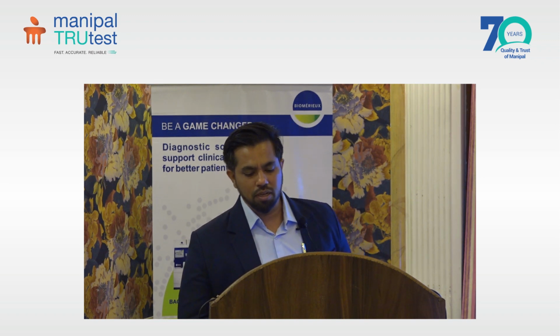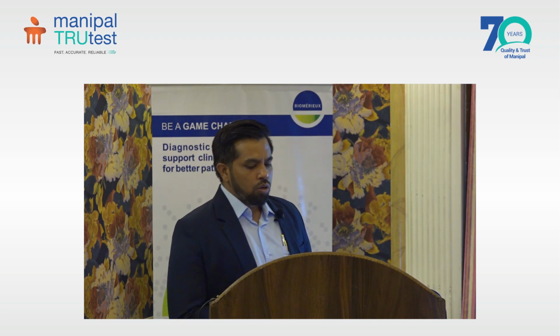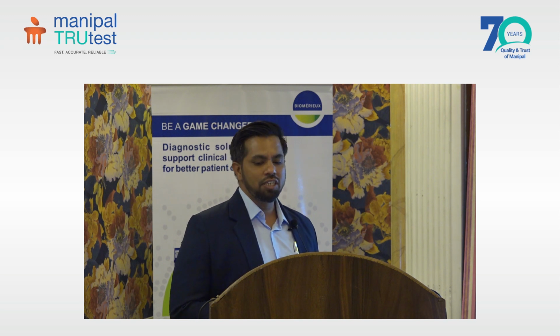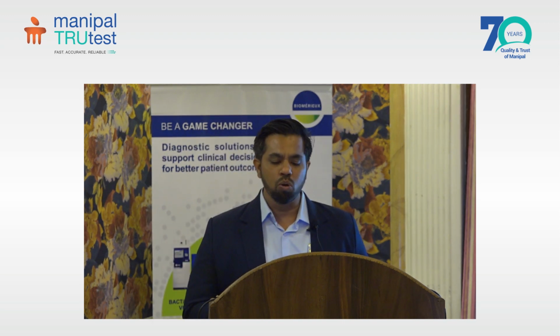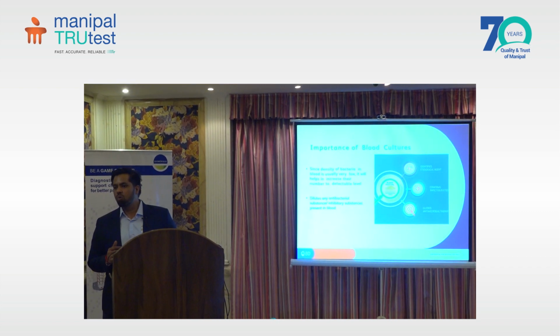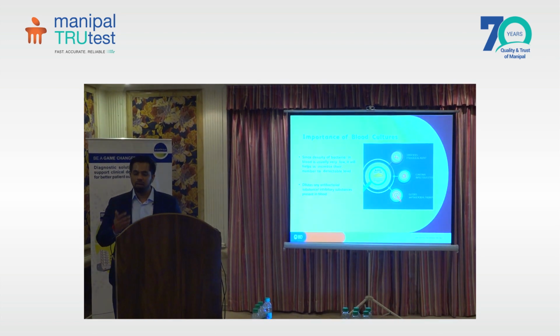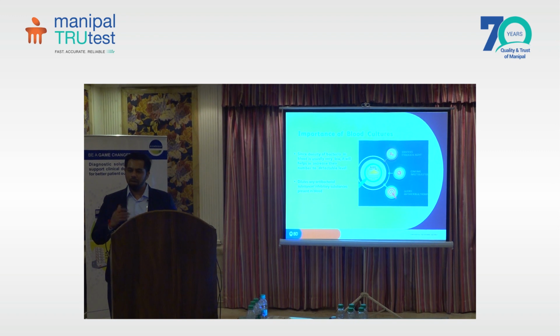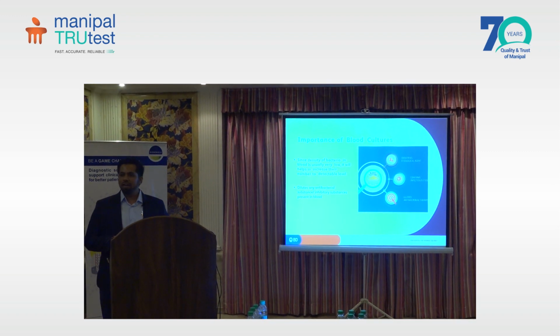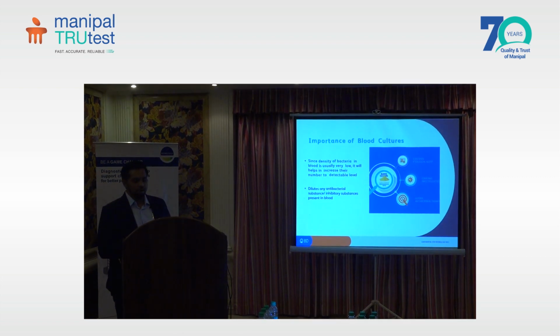That may lead to sepsis for the clinician. So the blood culture, as I said, is a key investigation for diagnosis of sepsis and is considered gold standard. It is used to detect the presence of bacteria, that is bacteremia, and fungemia in the blood. Since the density of bacteria in the blood is very low, it is important that it should be increased to the detectable level, and it can be done only by blood culture. And another advantage is that it also dilutes any antibacterial substance which might be present in the blood.